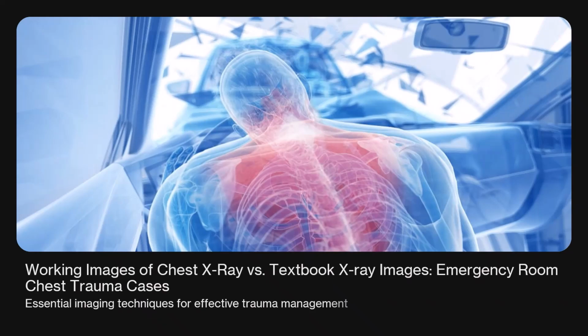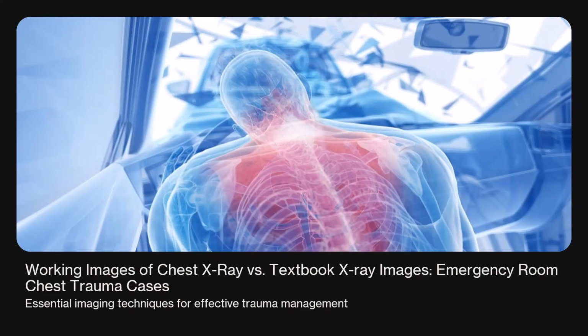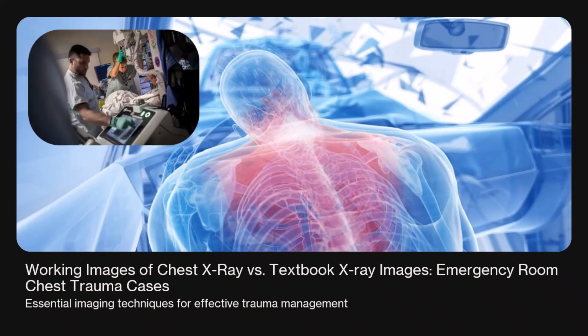This presentation focuses on the critical role of portable chest imaging in trauma cases in the emergency room. We will cover the different types of trauma, assessment protocols, imaging techniques, interpretation, and the integration of the findings into patient care. To begin, we will identify what is the role of the radiographer in trauma imaging.